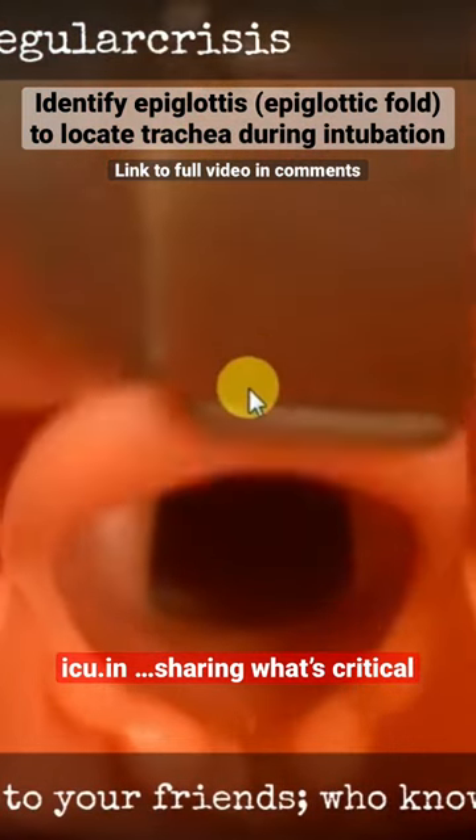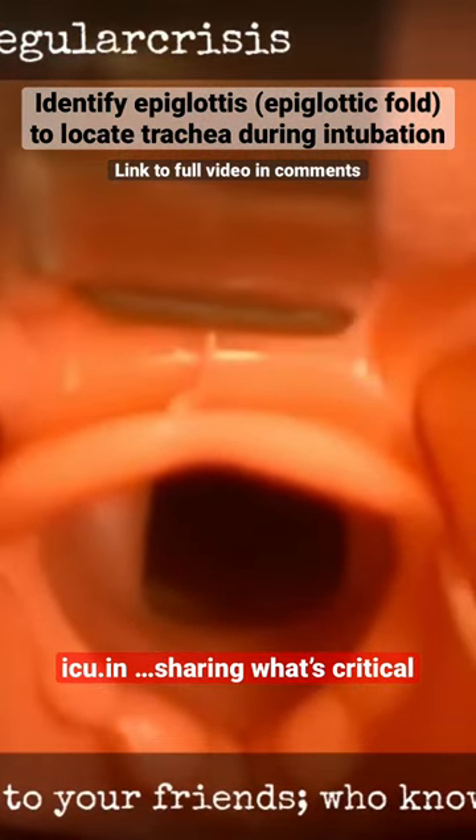You can see here this laryngoscope is going in. This is the tongue which is coming down, this is the epiglottis, and this is the trachea just beneath the epiglottis. You have to reach in between the fold which is found by this tongue and the epiglottis.